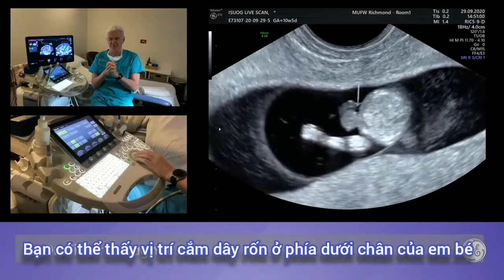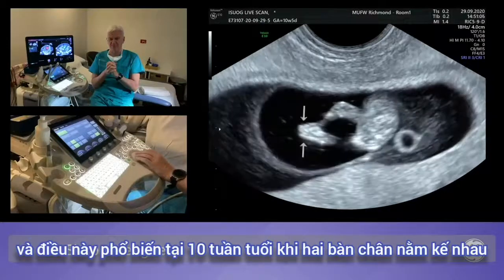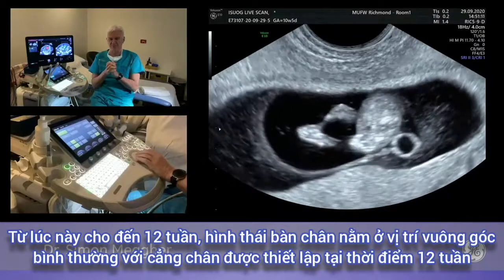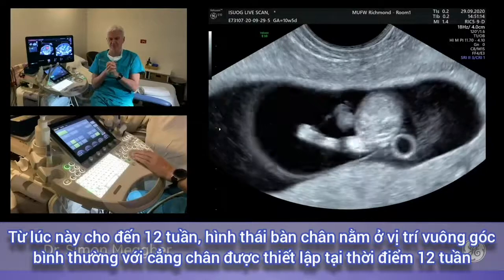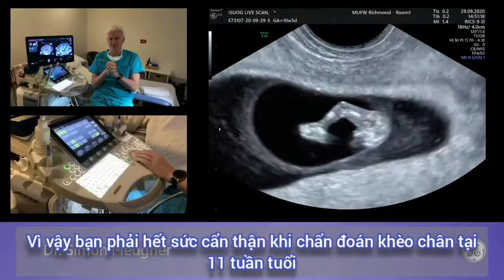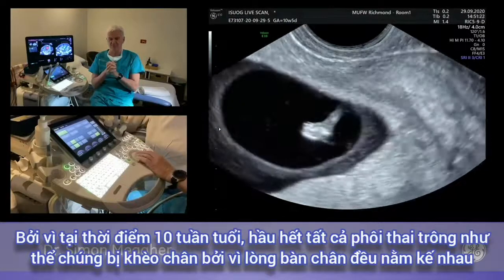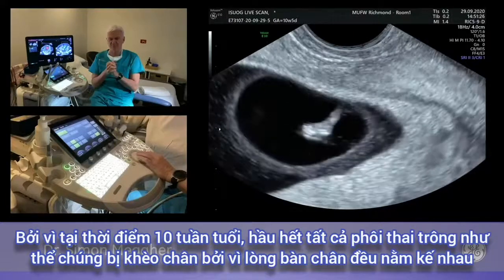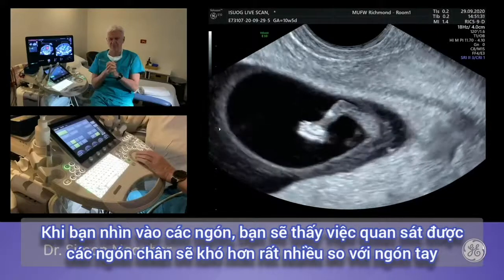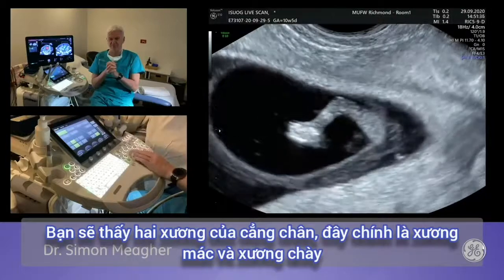The cord insertion down onto the baby's legs is visible. It's very common at 10 weeks for the feet to be juxtaposed. Between now and 12 weeks, eversion of the foot occurs, and the normal perpendicular position of the foot relative to the lower legs is established by 12 weeks. You need to be very cautious about calling talipes at 11 weeks, because at 10 weeks almost all fetuses look as though they have talipes as the soles of the feet are juxtaposed. You can see the two bones of the lower leg: the fibula and the tibia.